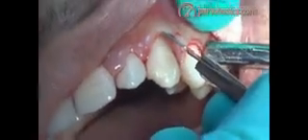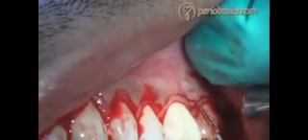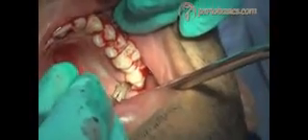Now you can see the malformed gingival margins, so we have to include these in the incision so that a fine gingival margin can be achieved. Now you can see here that the incision line is very clear, and we have a triangular wedge of tissue after we have put this incision.